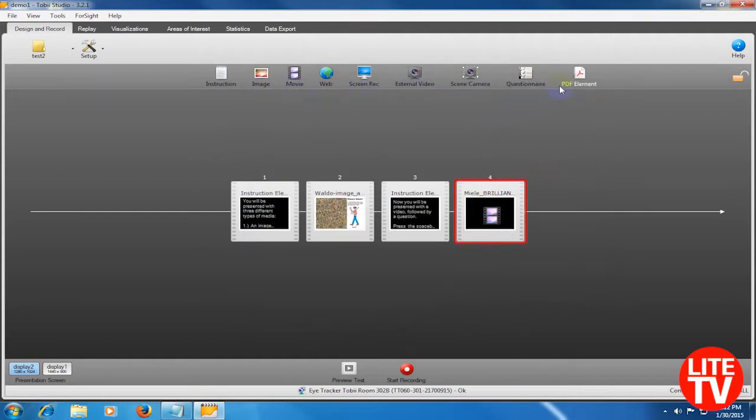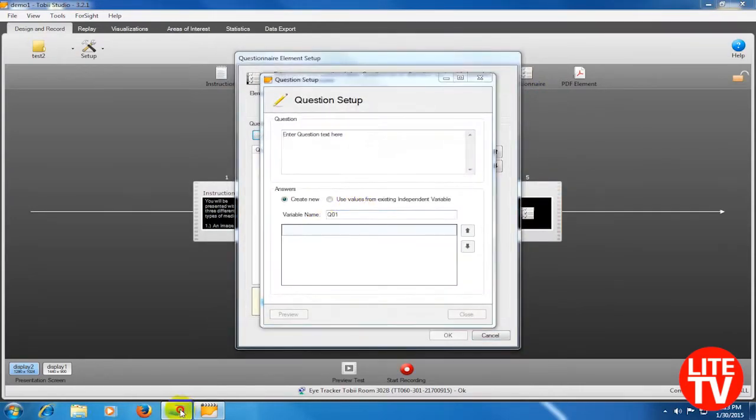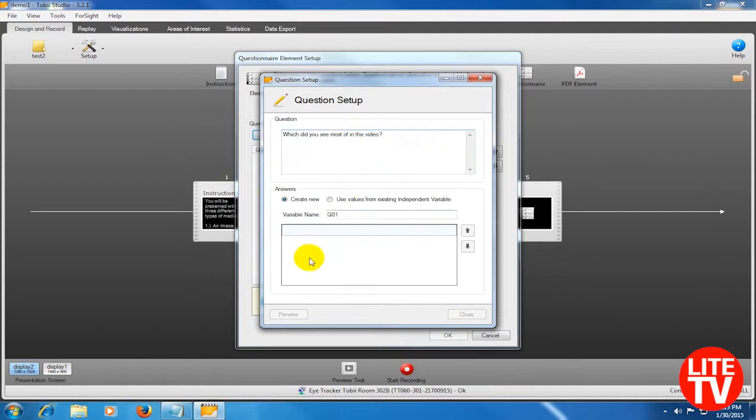Okay, so after the movie, I'd like to add some more questionnaire to it. So I'm just going for the questionnaire tab, as you can see. I have some questions ready. So these questions can be multiple choice, so I need to give some choices.